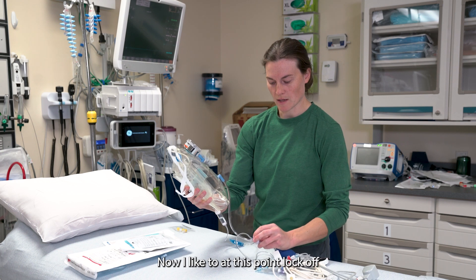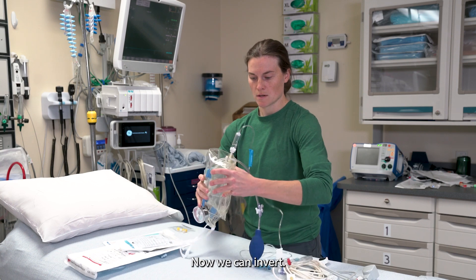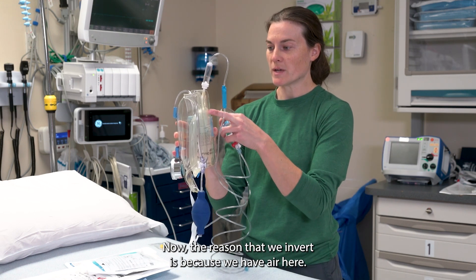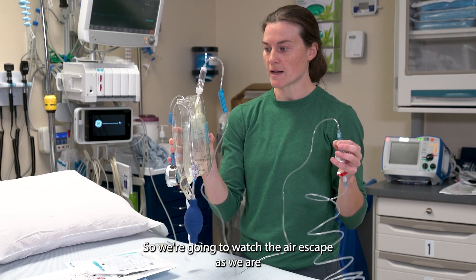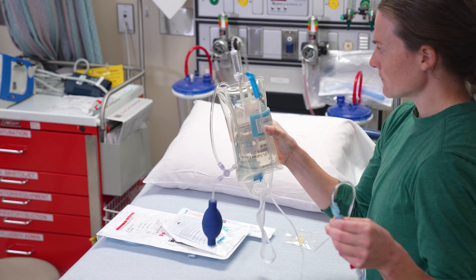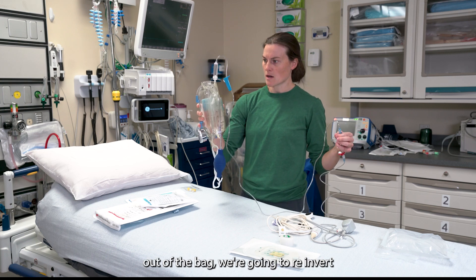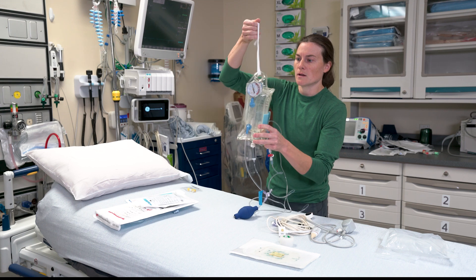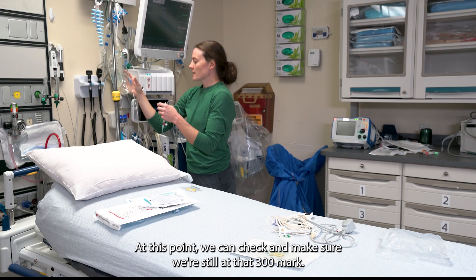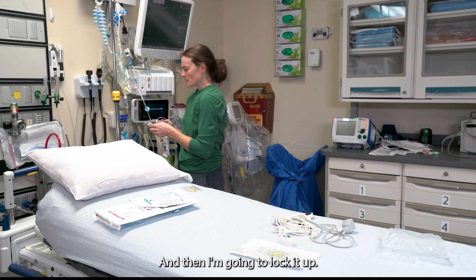At this point I like to lock off so no air can escape. Now we can invert, and this is the part where we're going to pressurize this cable. The reason that we invert is because we have air here — air is lighter than the fluid — so we're going to watch the air escape as we pressurize. Once we feel like we have all the air out of the bag, we're going to re-invert and then hang it up. We can check and make sure we're still at that 300 mark. We're a little bit below it, so I'll put just a little bit more air in it, and then lock it up.